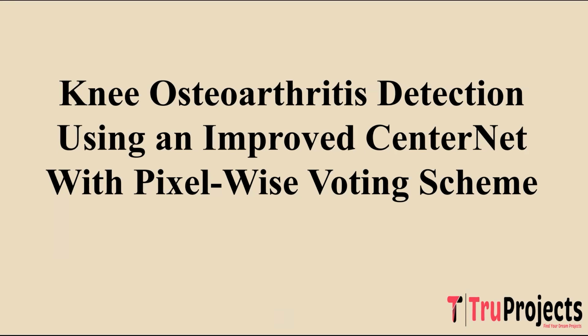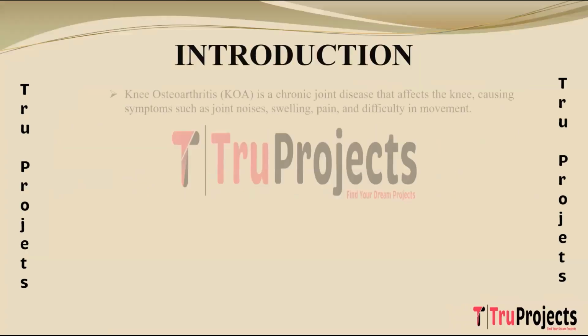Projects. In this video, we are going to explain about the project titled Knee Osteoarthritis Detection using an improved CenterNet with pixel-wise voting scheme. Introduction.